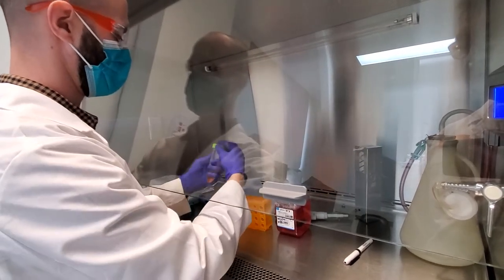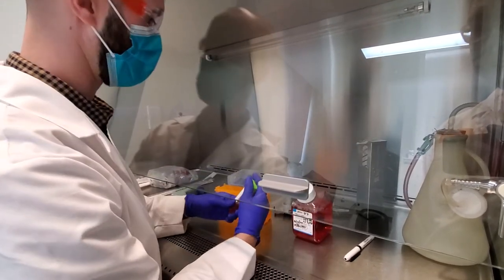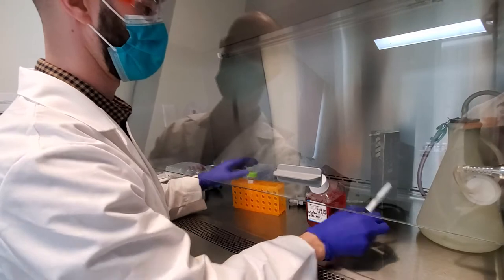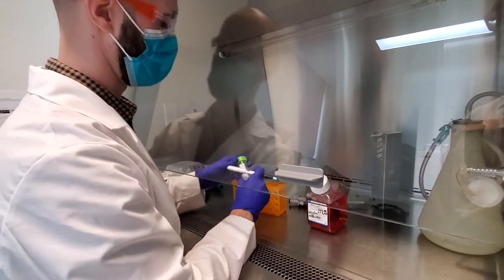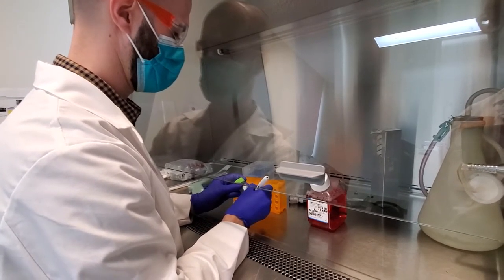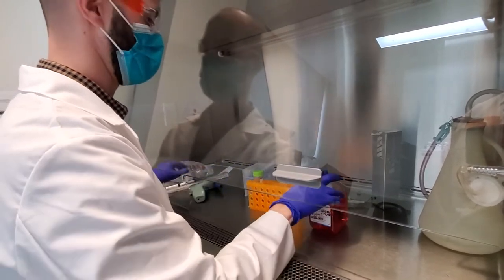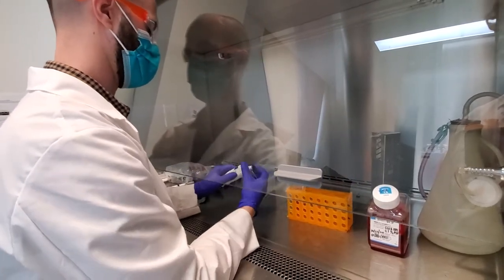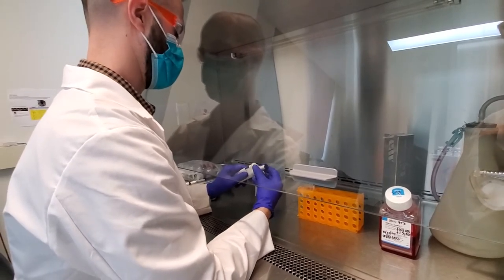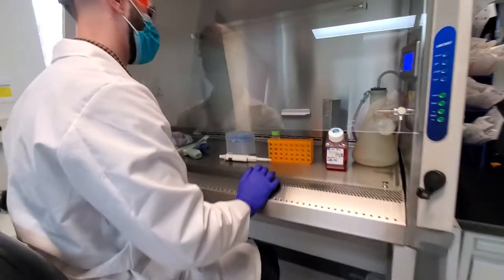Okay, so that's ready. If this is right out of the 4C, you can put this into the bead bath for 10 or so minutes or a little bit more to warm up. If you're moving this around and there's other people in the lab, it's a good idea to label it. I'm just going to set this up and get it ready to go, because you want the next part, when you're thawing cells, to go pretty quickly. As soon as they're thawed, get them diluted right away. Okay, so now we're ready for that.